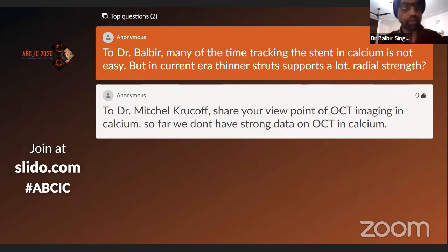Okay, so first thing is that the majority of the stents now available are thin struts. So some people have gone down to 64. So the fact is that when one stent has been compared to another stent, most of the studies have excluded heavy calcific lesions. So they have taken simple lesions. So how one will behave against another in a calcific lesion is very difficult to assess. But I would like to choose a stent which has high radial strength.